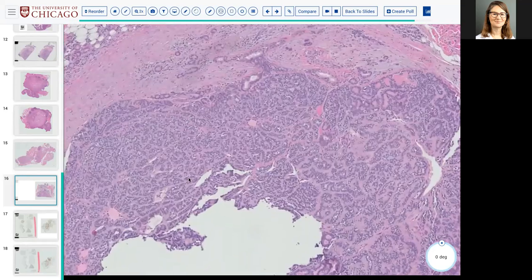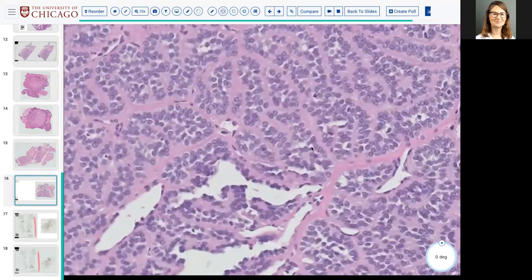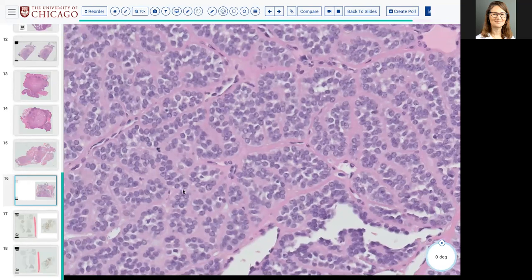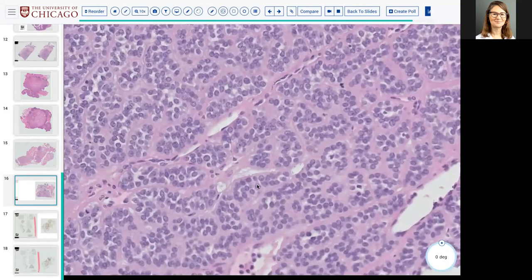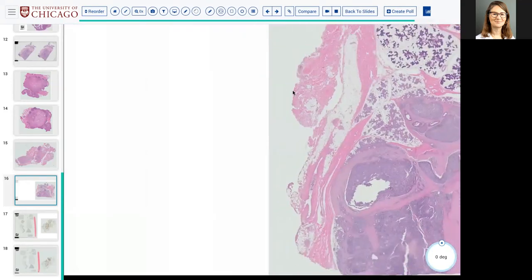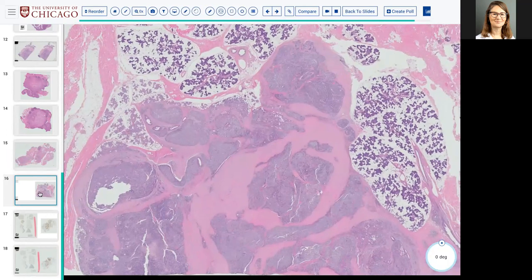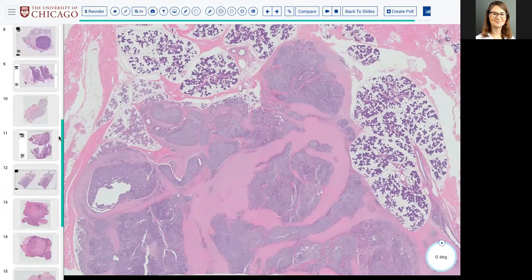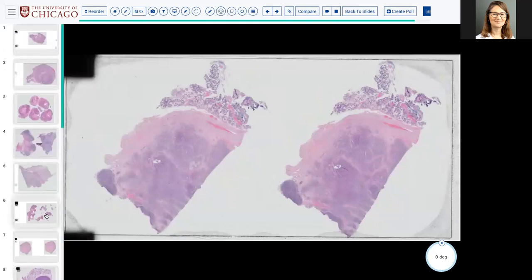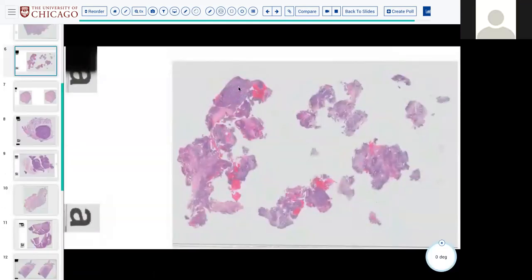The other tumor that one might consider, you guys mentioned it already, what's our other very common biphasic salivary carcinoma? Adenoid cystic. And this does not appear to have the very wrinkled dark nuclei of an adenoid cystic or the cribriform architecture, et cetera. So this to me is epimyoep rather than adenoid cystic. I know we're jumping around here, but should we look at the adenoid cystic? Which one was it? Slide 6. Yeah.